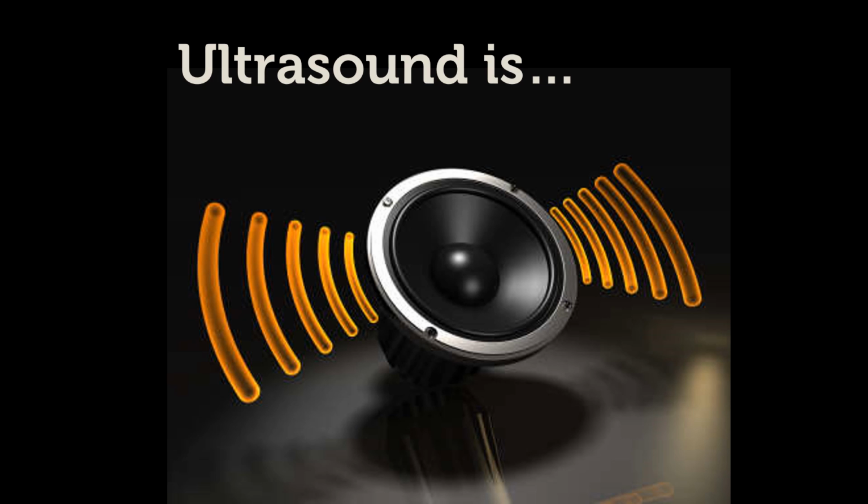Sound is a form of mechanical energy and involves the physical movement of particles within a medium. Sound waves can only exist in a medium that contains molecules such as water, air, or soft tissues. Sound waves above 20,000 Hz are above the range of human hearing and are called ultrasound. Medical diagnostic ultrasound uses a frequency range between 1 and 18 MHz.